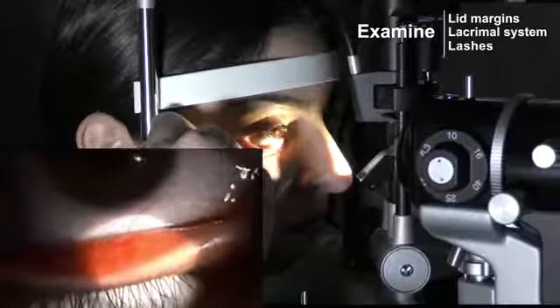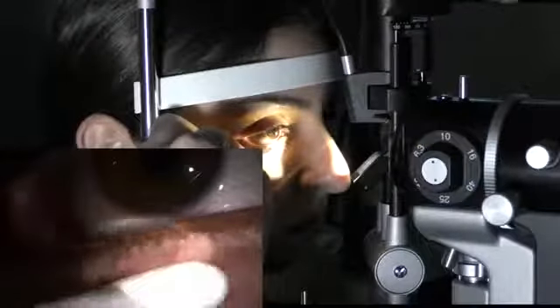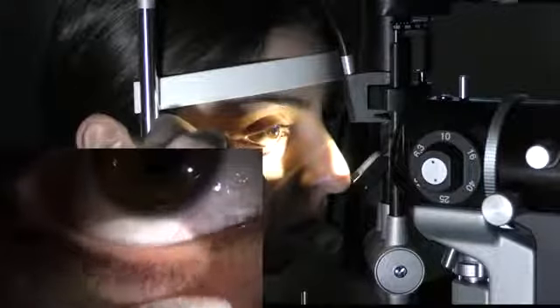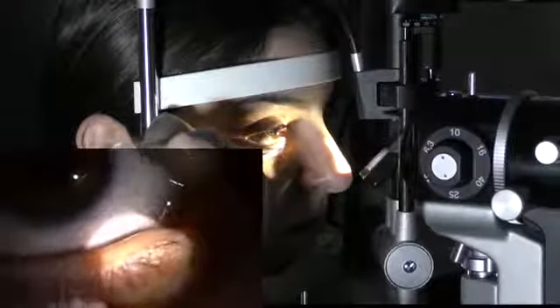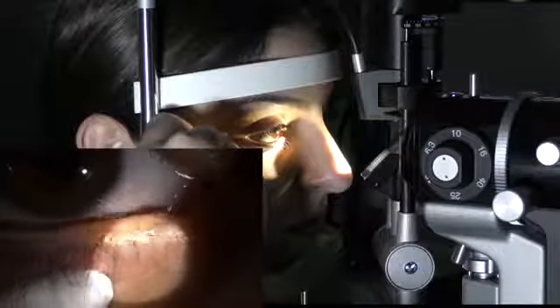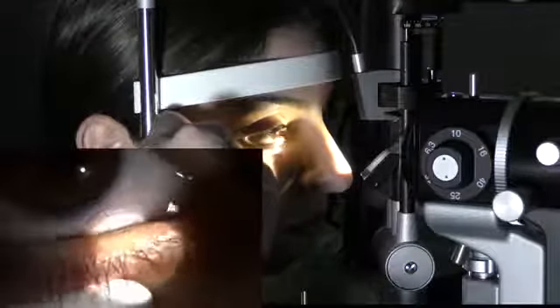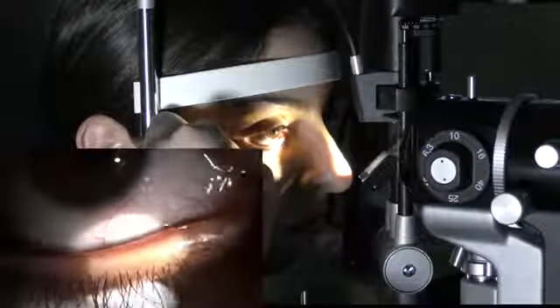Move across, okay, look at the lid margin. If there's any notching or change in contour of the lid margin, you should be wary of that. Any little notches could be signs of blepharitis, so look for that as well. And then you want to move out and look at the lashes, okay? Very important to look at the lashes. Look at the lash follicle itself. Are there any collarettes, any signs of scurf, which basically is that white debris on the lashes. That can be, again, signs of blepharitis, okay?